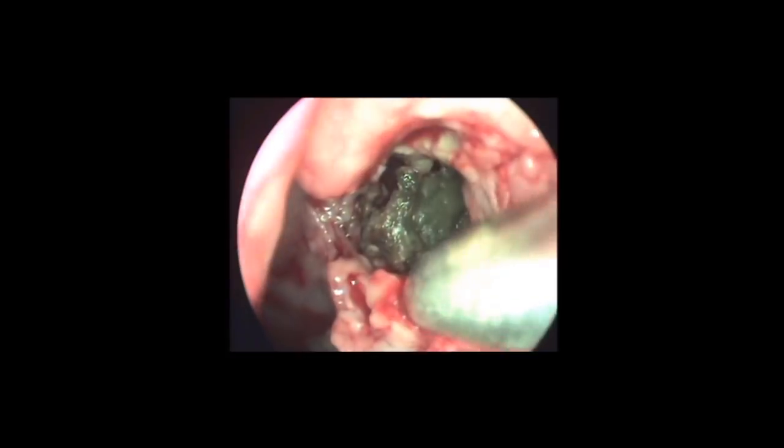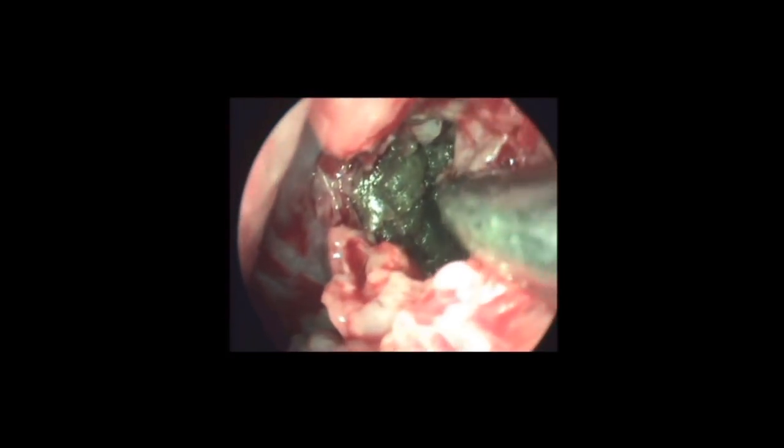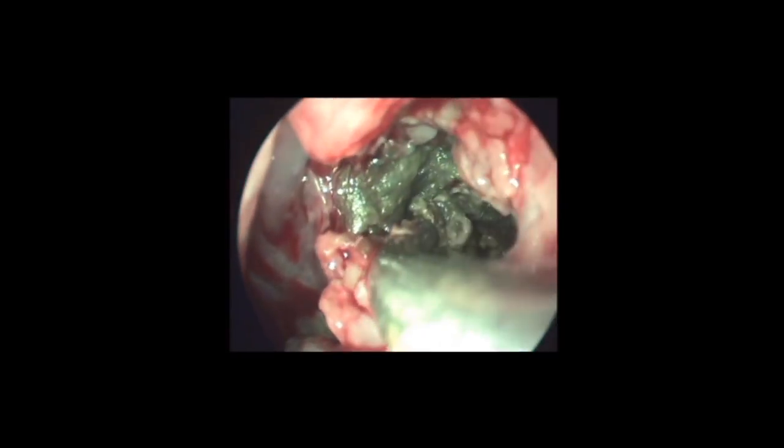Using a 45-degree scope, the deeper parts of the maxillary sinus are visualized and the remaining debris are being removed.